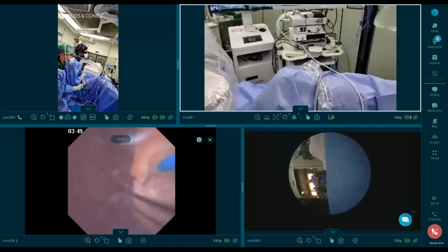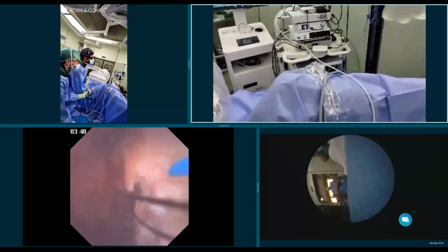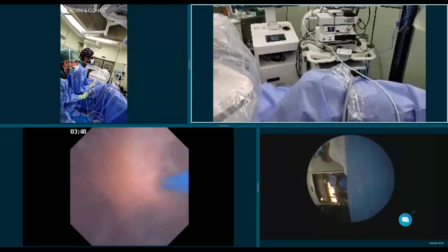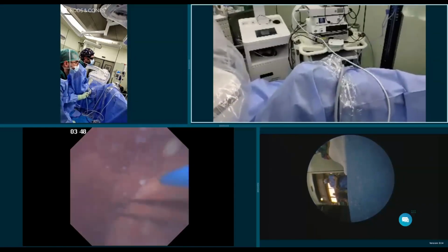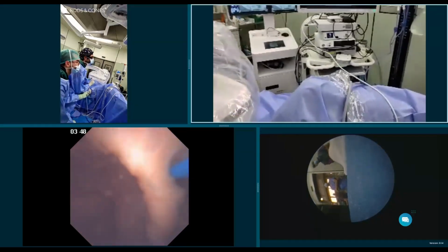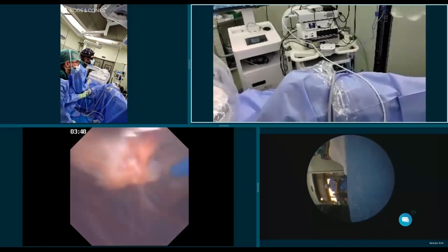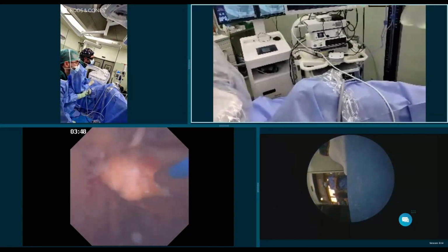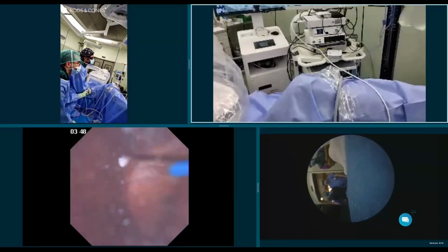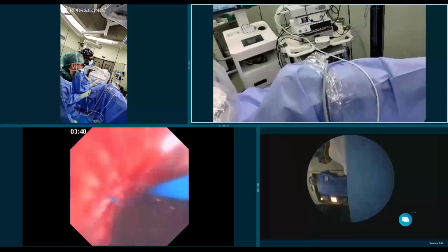So we're dusting very well here. There's suction now at this moment. You can see here that there's a good and clear view all the time. This is good. Remember that we have two instruments on the working channel because we were stuck here. But this gives us the opportunity to aspirate and have some passive aspiration. We will have some aspiration without the irrigation initially, so the idea is to be very efficient with the dusting.